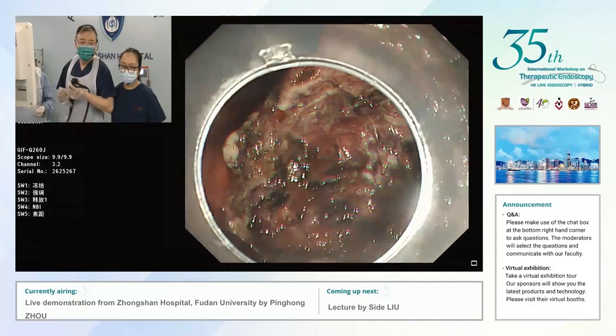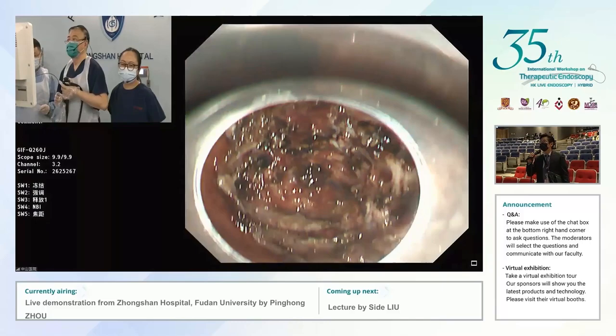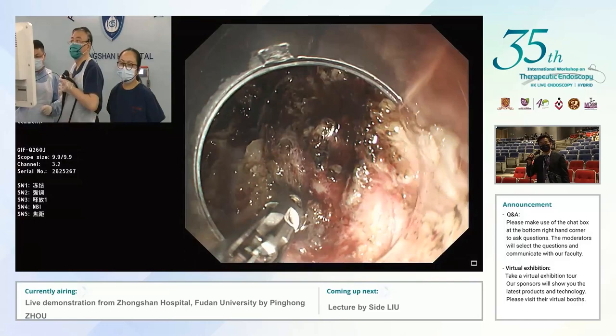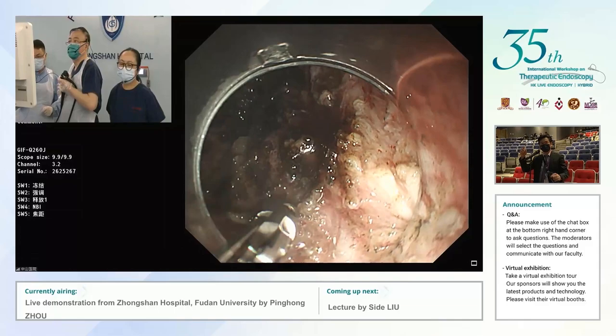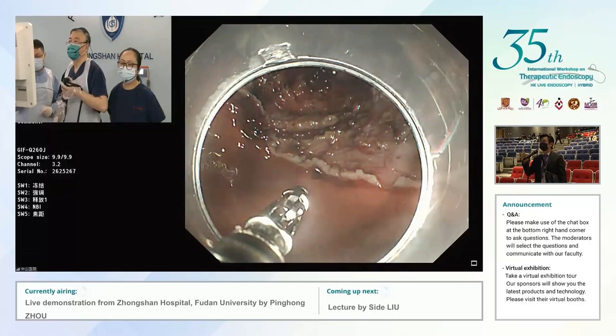Hi Ping Hong! I can see this is a very difficult lesion. For this big defect, we would try to use the over-stitch, but clip and loop is also a very safe method — I fully agree with Professor Chow. The X-Tag is difficult because you only have four tags and can probably only close one to two centimeters. For this big defect you may need multiple. So over-stitch or clip and loop may be a better choice.